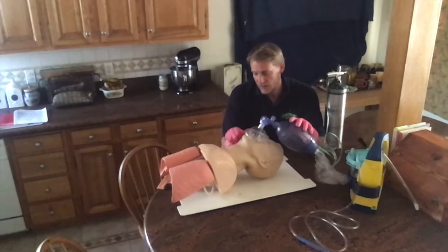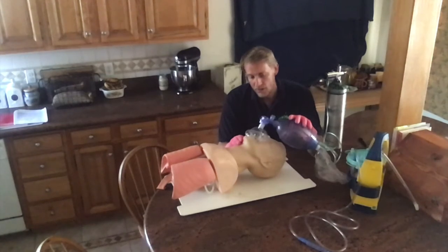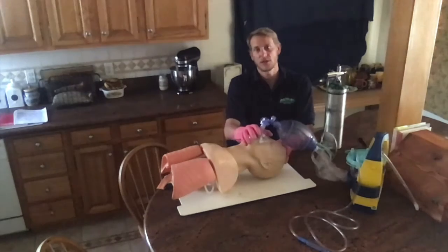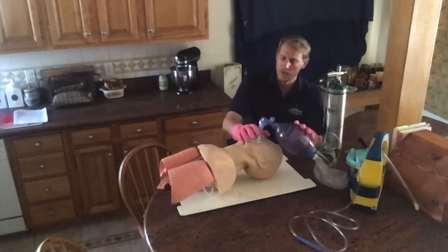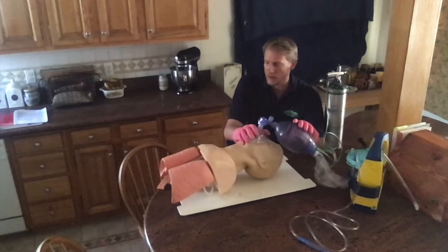Since I've given a few ventilations, I'm going to recheck the carotid pulse for no more than 10 seconds. The patient's condition appears unchanged, so I'm going to continue ventilations and count them off for one minute.